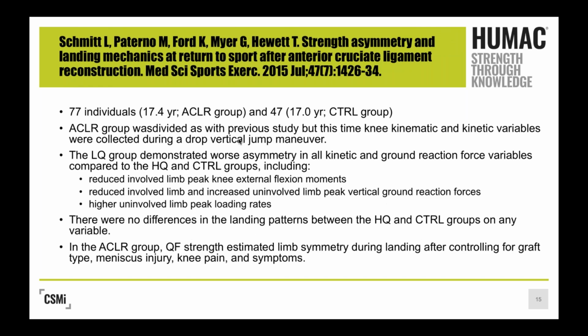All right, the second study by this group, they used the same subdivision of their ACL groups, so the high quad and low quad strength. But this time they collected kinetic and kinematic data during a bilateral drop test using force plates. So they dropped off of a raised platform onto both legs at the same time. And they also used the 10 camera motion analysis.